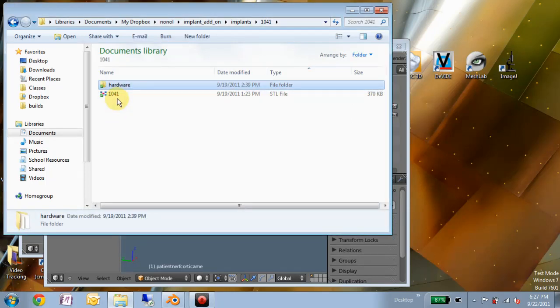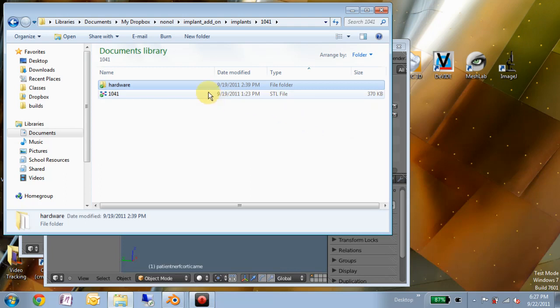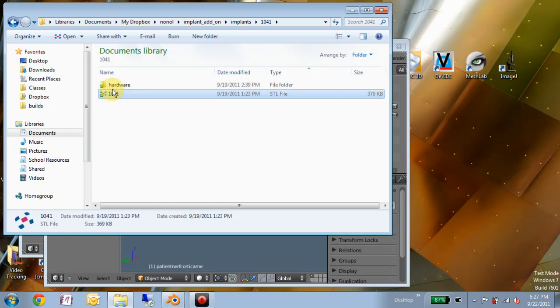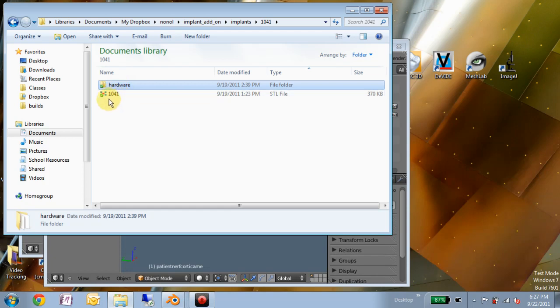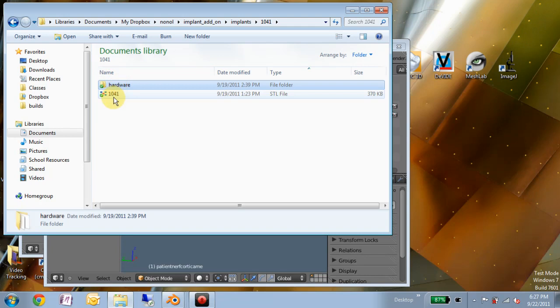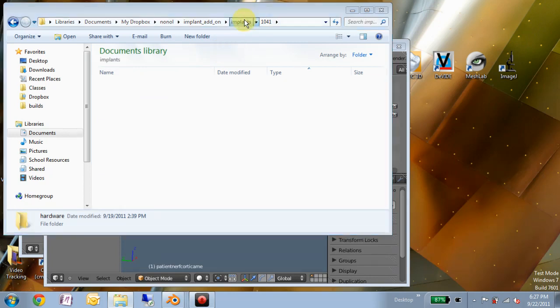If there's some other standard for how normal implant files are stored, we can always adapt. I can adapt my script to fit any kind of organization, as long as we have good access to the models and we know exactly the standard by which they're saved. That can all be adapted later. So this is just proof of concept.